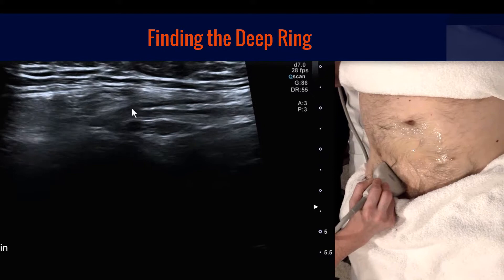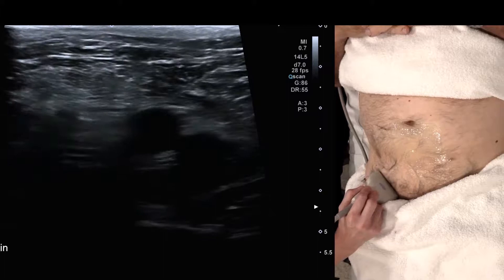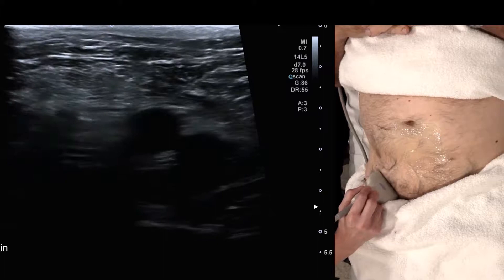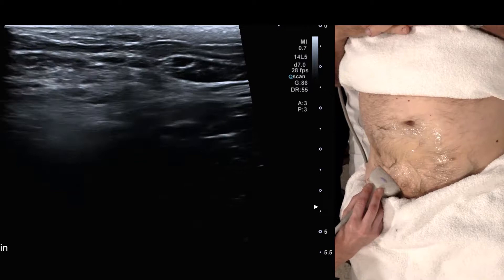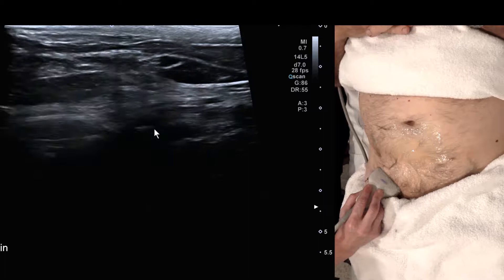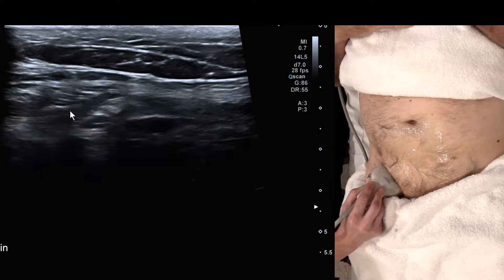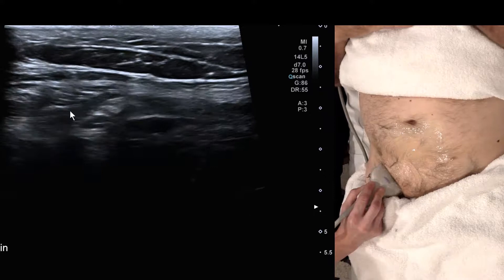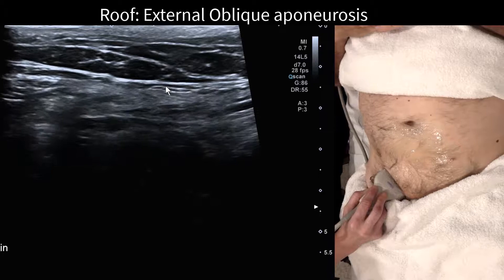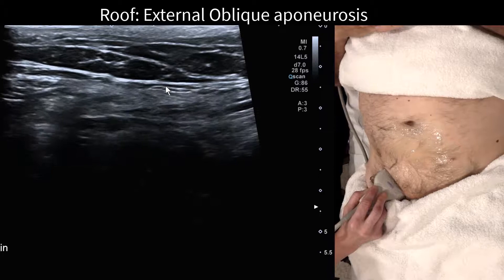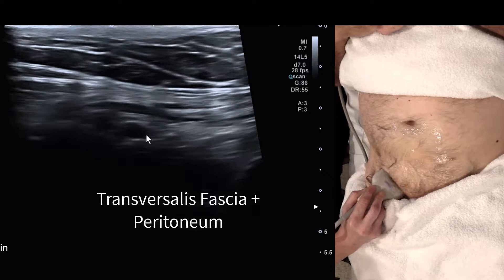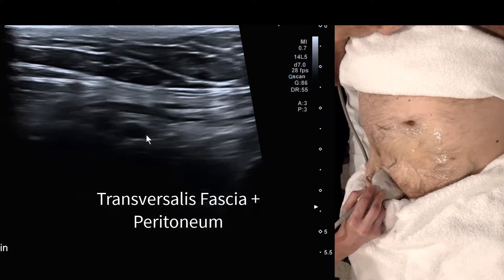We're ready to perform a Valsalva maneuver, but if we leave our camera directly on top we're likely to get pushed off. Take a leap of faith and slide laterally in the same orientation, laying the camera flatter so we come in on the side of the deep ring. We're looking for the veins dropping into the abdomen, the inferior epigastric artery, and in front a little muscular triangle which is the internal oblique terminating into its fascia. The roof of the inguinal canal is the external oblique aponeurosis, and at the back of the spermatic cord the posterior wall is formed by transversalis fascia and peritoneum.